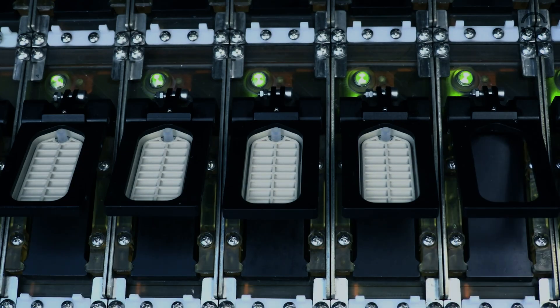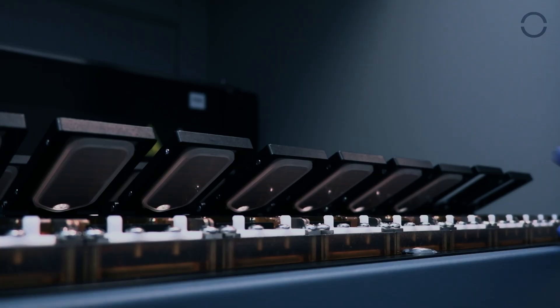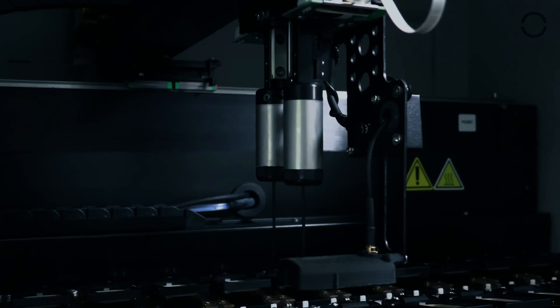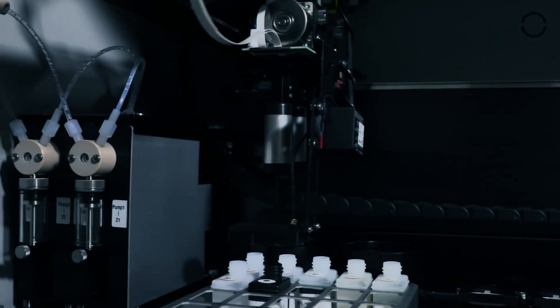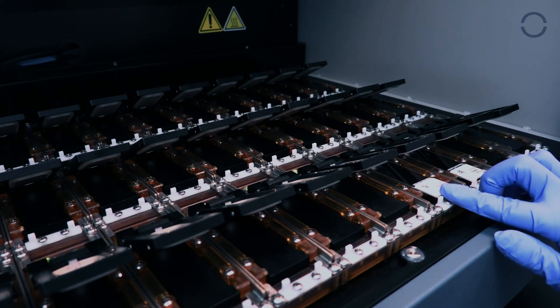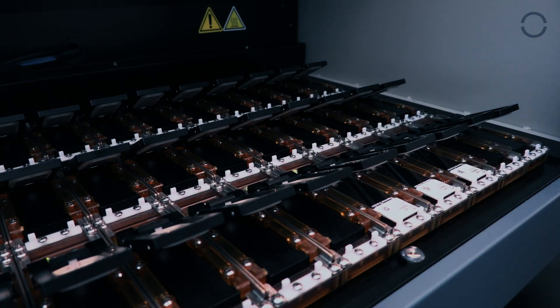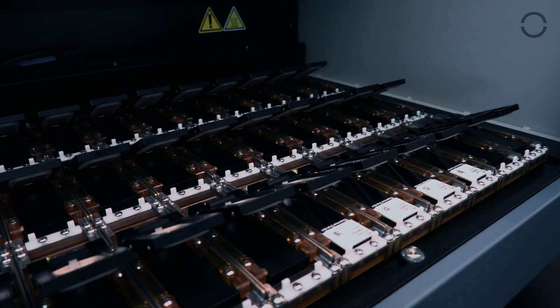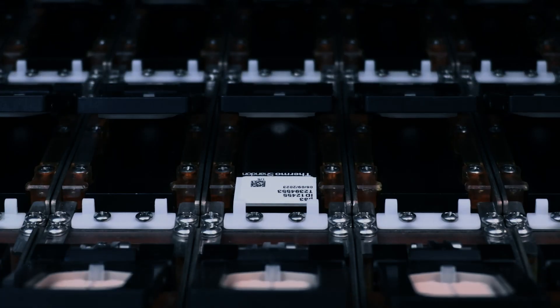36 individual slide chambers allow any run combination, no sorting required. Chamber lids decrease the amount of antibody needed for staining and gently agitate the slides during the run for strong, consistent results.